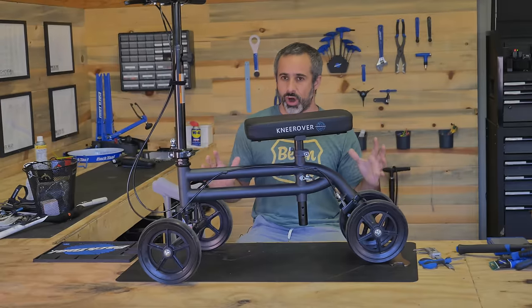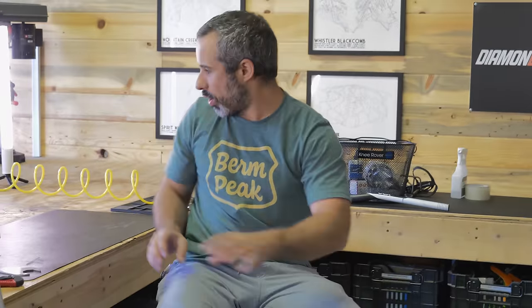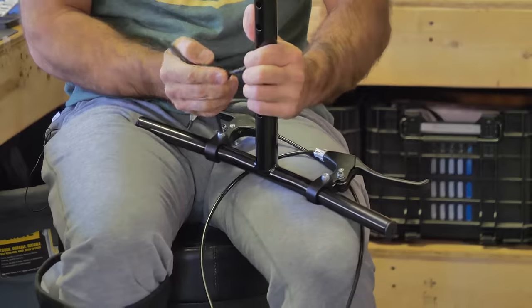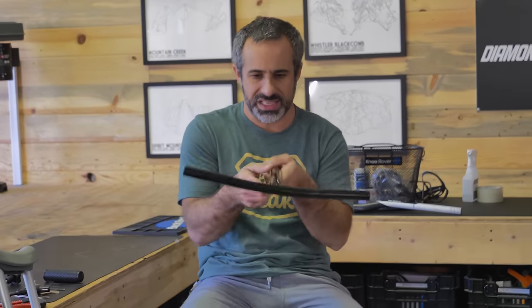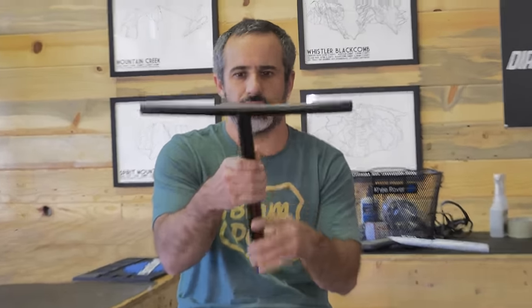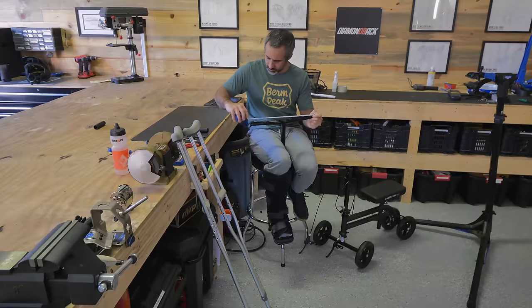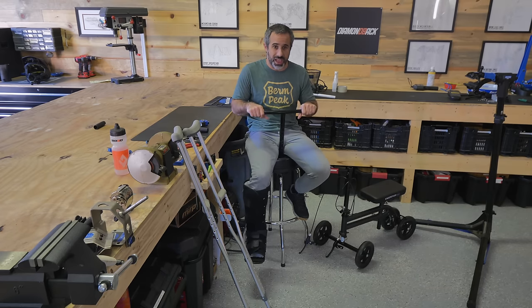We're starting with carbon bars. There's no stem on this so we can't just put a stem and attach some bars to it — we're going to have to do some fabricating. Let's take this all apart first and get these grips off. So we are left with the original knee rover handlebars. You can see they don't have much rise or sweep to them — not going to be very good downhill. Also they're pretty narrow at 400 millimeters, but that's actually pretty good because we want them narrow enough to get through doorways with ease.